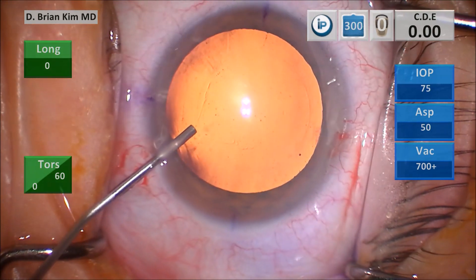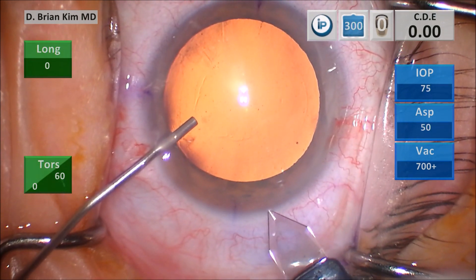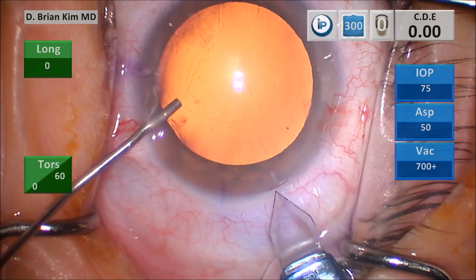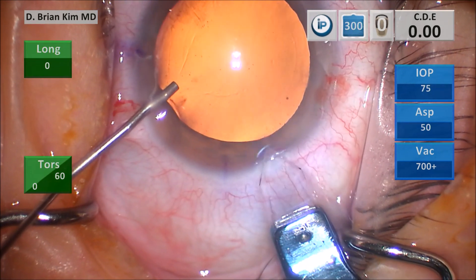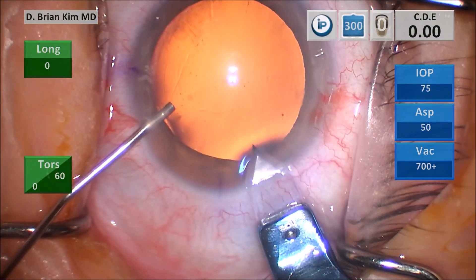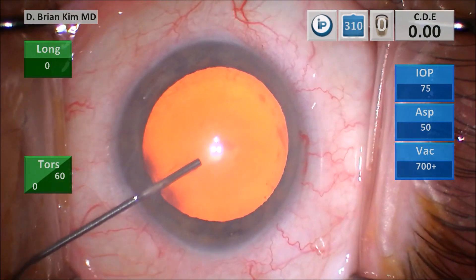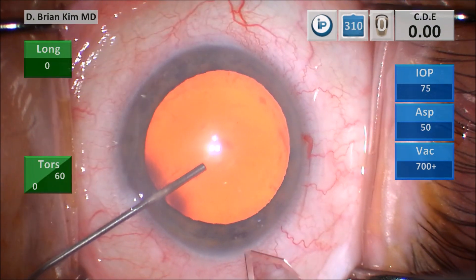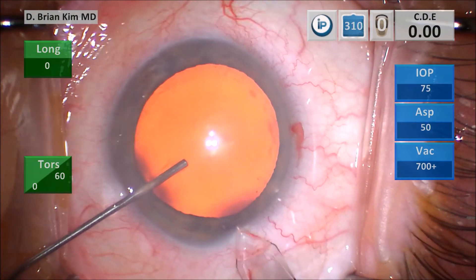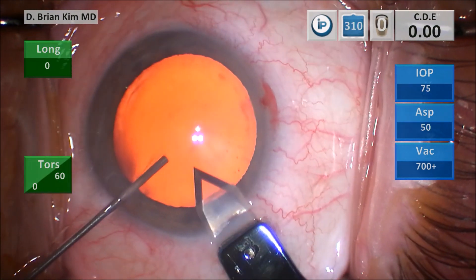I like to keep the cannula just right at the tip of the incision. Here's a pearl: if you think the patient will tend to move, you can secure the eye better with the cannula by creating an oar lock — rotate the cannula counterclockwise so it twists along the incision, creating a little tension on the incision so you can hold the eye with more security. Then you make your vertical groove, tunnel, reposition, and puncture through.